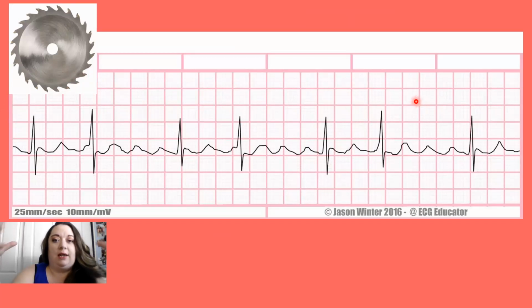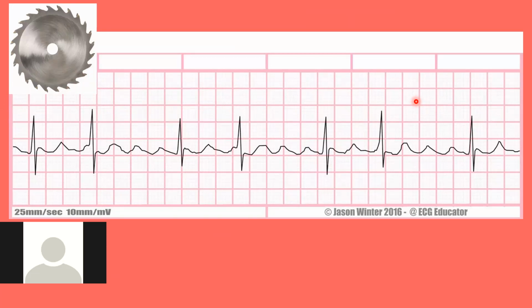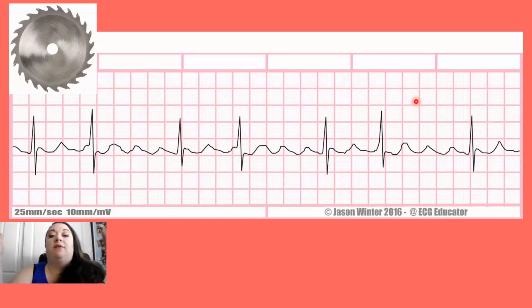Have you guys realized that you can actually figure out the atrial rate versus the ventricular rate? Would the atrial rate just be counting P waves? Yeah, that's it. So especially if the patient gets sick and you get more heavily into cardiology, whenever we look at a rhythm, what's the rate? We're technically always going by the ventricular rate, but you can count them out individually. So for example, let's count P waves. This is 1, 2, 3, 4, 5, 6-ish, 7, 8, 9, 10, 11, 12, 13, 14. So I have an atrial rate of 140. I have a ventricular rate, by counting my QRSs, of 70.